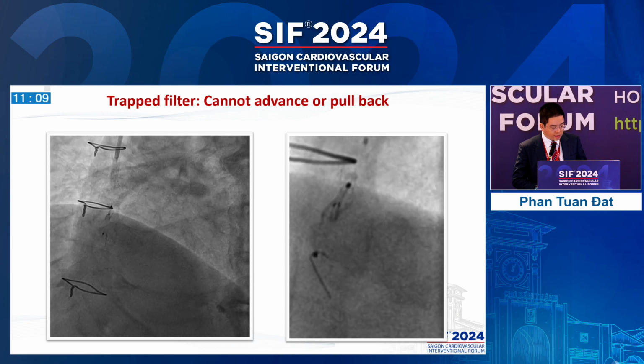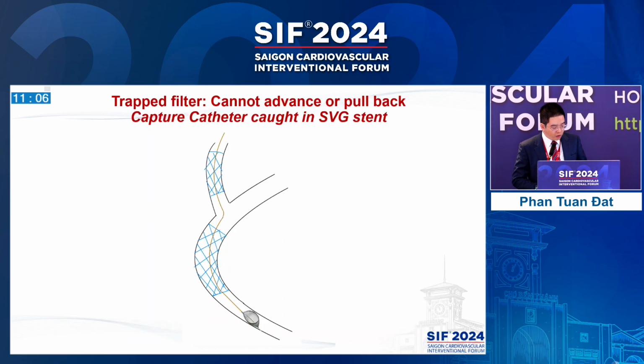This leads to deformation of the distal portion: the stent was compressed and shortened at the mid RCA. So we think we have to illustrate what mechanisms have been proposed to cause the filter entrapment in my case. Two mechanisms have been proposed here.